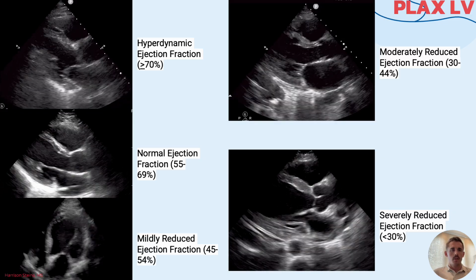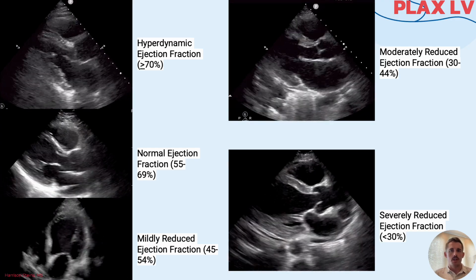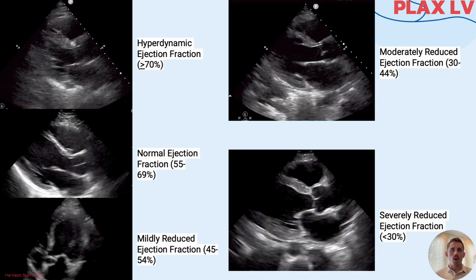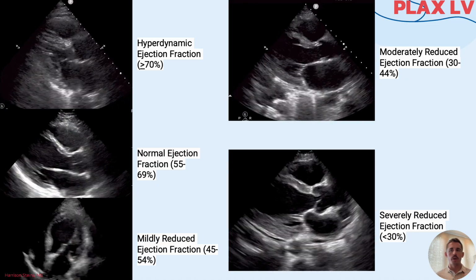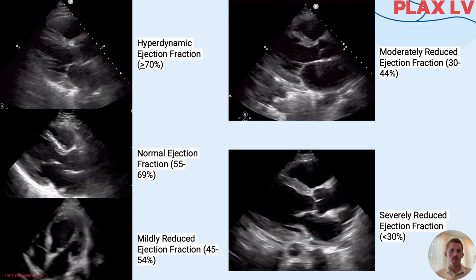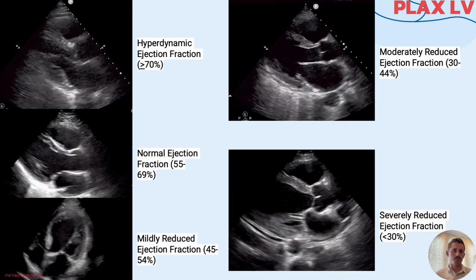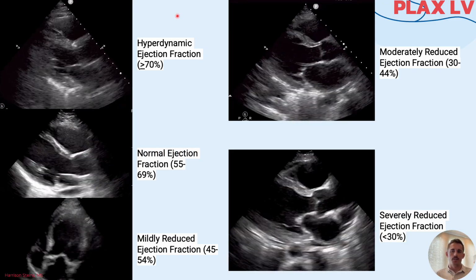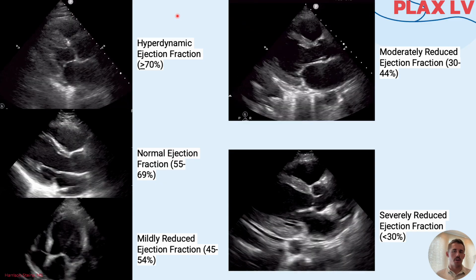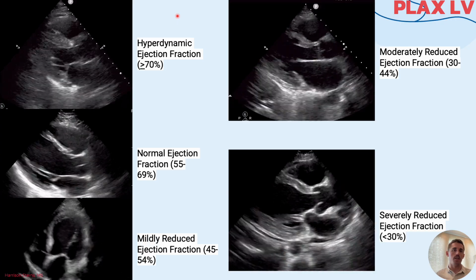So moving on, from this parasternal long axis view of the left ventricle, I've put up a couple of cine clips, and these cine clips are our way of doing a quick qualitative approach to estimating ejection fraction. This is the quick and dirty way of eyeballing: is this patient in severe heart failure, HFrEF, HFpEF, or do they have hyperdynamic heart function? And hyperdynamic heart function, seen up in the top left corner here, is mostly due to decreased preload, right? So you have cases of hypovolemia, catecholamine surges, underlying conditions like hypertension, sepsis, or changes in cardiac function that reduce that preload, needing the heart to work faster.